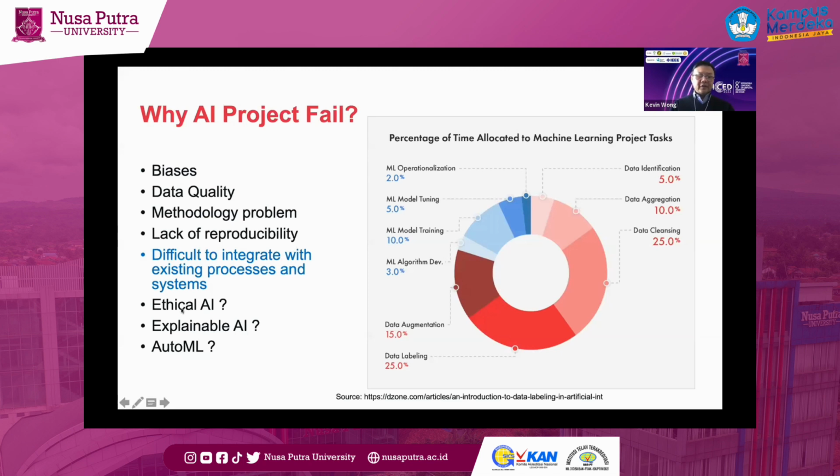All right. And of course, the last few, which is very important, ethical AI, because we need to protect the privacy and secure the data for the patients. And of course, when you predict something, at this moment in pathology, the human is still the final decision maker. We cannot fully rely on the machine to say whether you have cancer or non-cancer. And the next one, which I'm pretty sure those working in AI will realize, is explainable AI, which is very important and is getting very important in medicine as well.